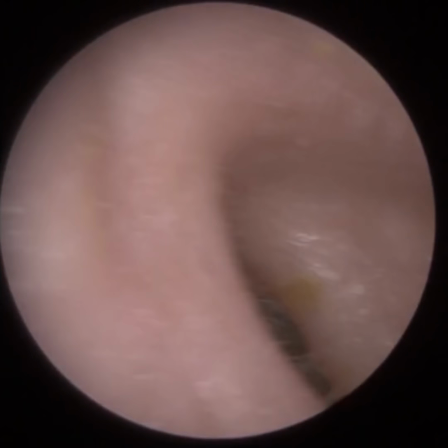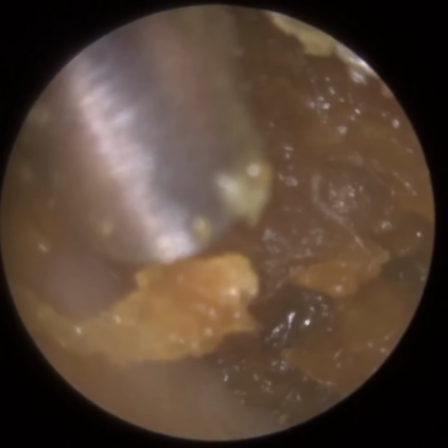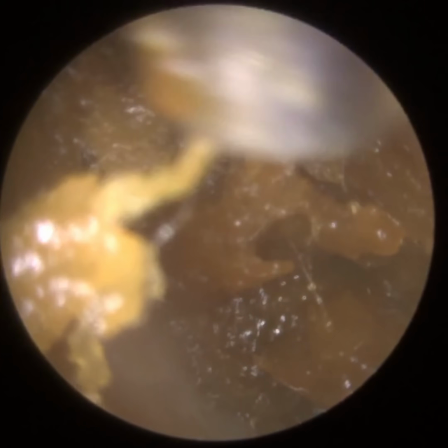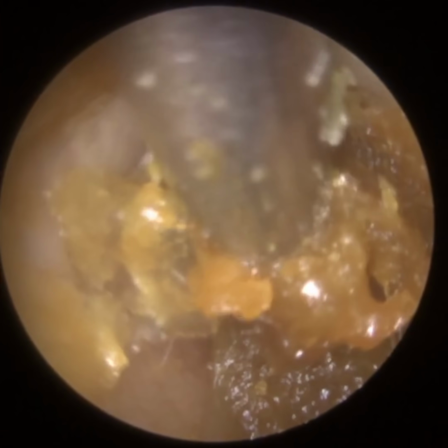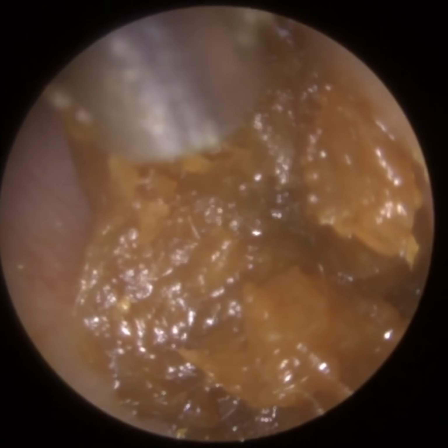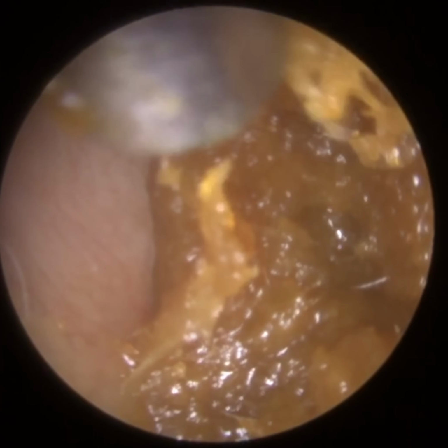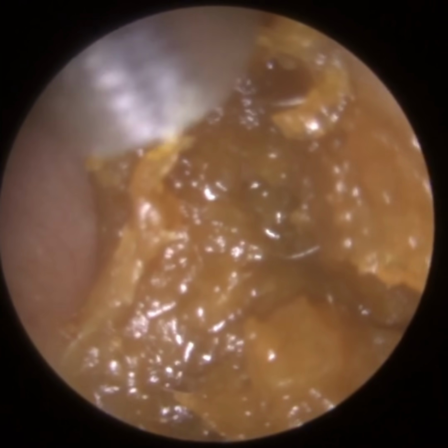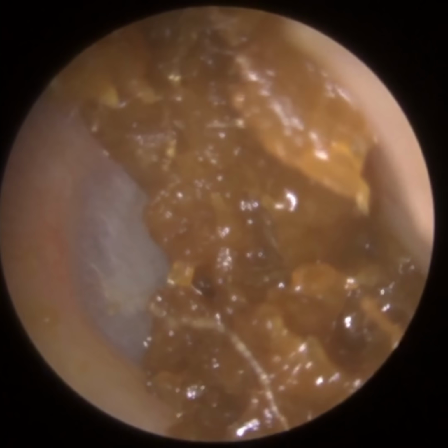And you can see I'm just wriggling the suction probe there, it just got blocked a bit. So we've removed the lateral, the more outer part of the earwax, so we're a bit more medial towards the eardrum. And again, I'm just taking this out layer by layer. I didn't really want to put any more drops in because the patient had really dosed their ear with the drops. And we're probably in the latter third of the ear canal now. You can see there's a bit of skin adhesions here around the edge, which is attaching itself not only to the ear canal wall, but also to the perimeter, the outer part of the earwax.